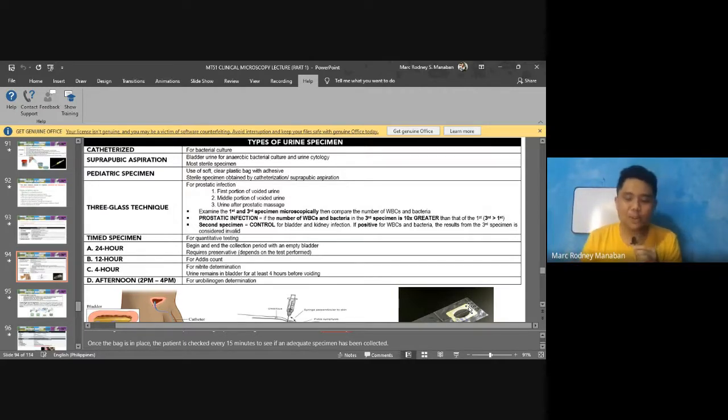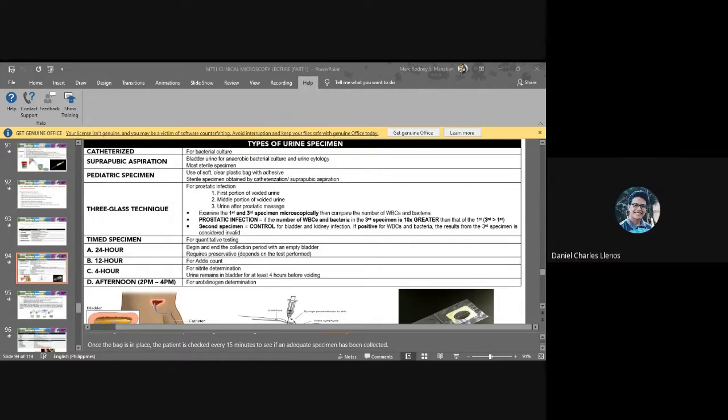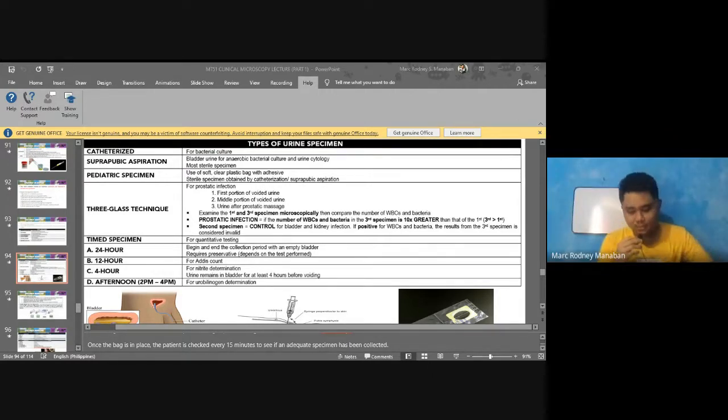Alright. Now, speaking of phlebotomy, as I mentioned earlier, especially when you go on ward duty, I really wish you get to try ward duty. When should you label your blood evacuated tubes? Before collection of the blood or after collecting blood? After? Okay? Is that right? Do you all agree? After collection of blood?